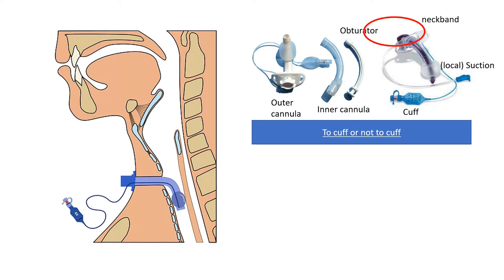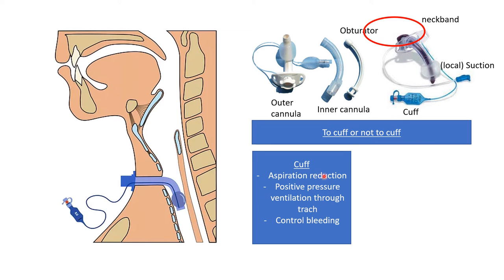Okay, so this question, to cuff or not to cuff: one of the nurses who educated us on this at Karolinska, who are really experienced in this, gave us good advice that whether or not you should cuff is a question of priorities, but you should always, as a care provider, ask why the patient is being cuffed, because the default should be not to cuff the patient, because of the mechanical strain on the area. That is the reason why you shouldn't cuff. There are other reasons as well, but that's one of the main ones.